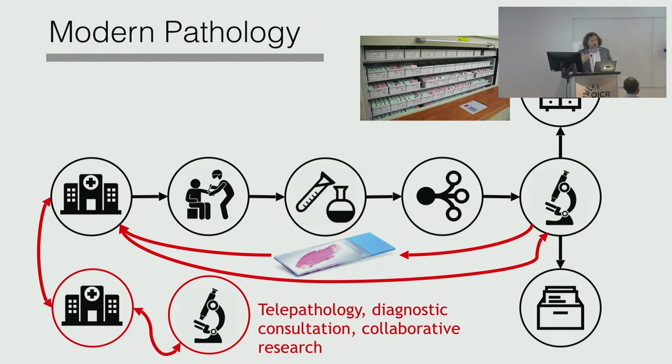It gets packed up, barcoded, zipped, and so on, to get a second opinion from a subspecialist if it is something tough. If it is lung adenocarcinoma, most likely we don't need to do that. That's a common case, and there is a lot of expertise on that. But if it is some rare type of cancer, we need to do that. And that's one of the reasons that diagnoses get delayed. A lot of physical transport.